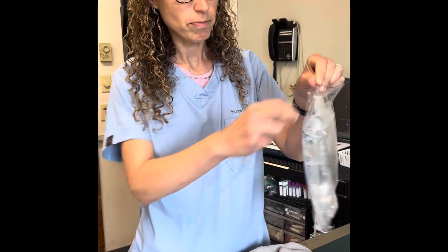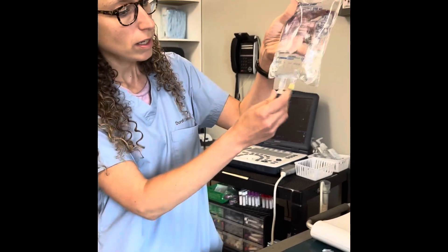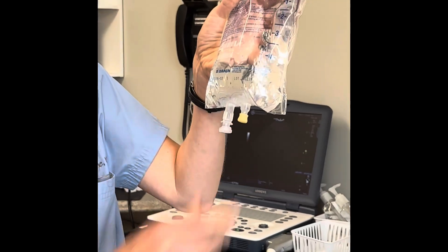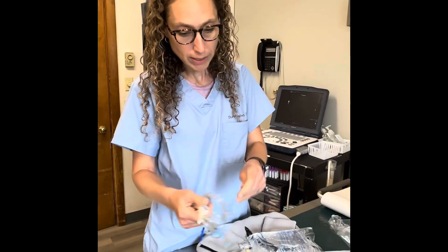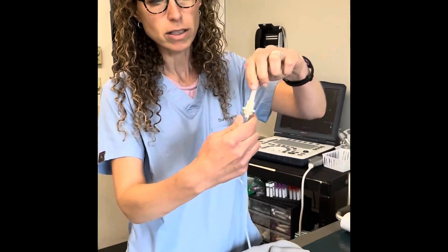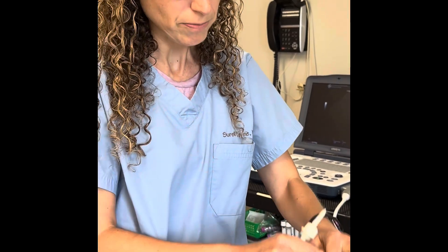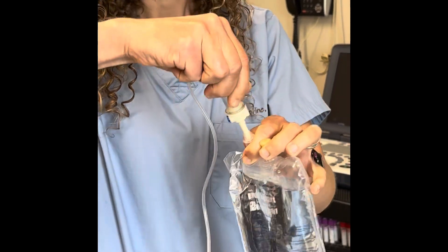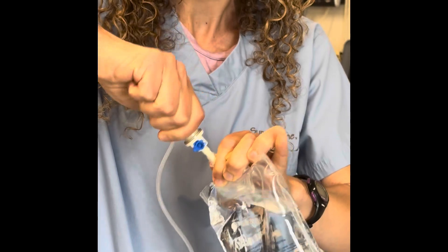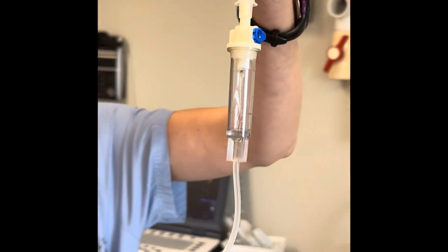It usually comes in the outer bag. I'm going to take the fluid out — this is a port for injecting and this is a port for your fluid line. So I'll open up my fluid line. This is all sterile under here, so I'm going to take off the cap so I don't touch anywhere up there. This is also sterile. I'm going to take off that cap and put this in without touching anything until it's fully seated. So now that's in, and you can see the fluid dripping through the chamber and going all the way down the line.